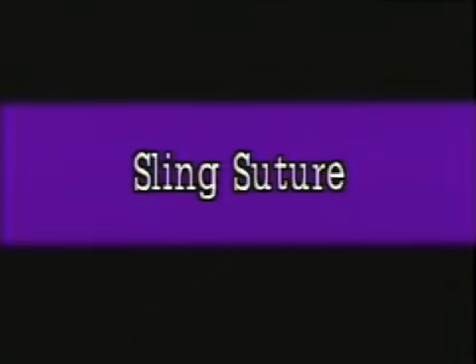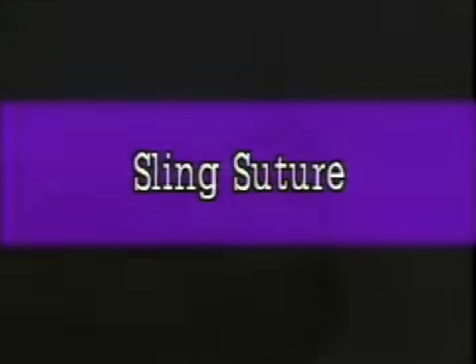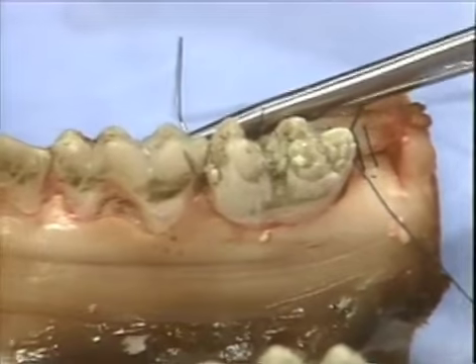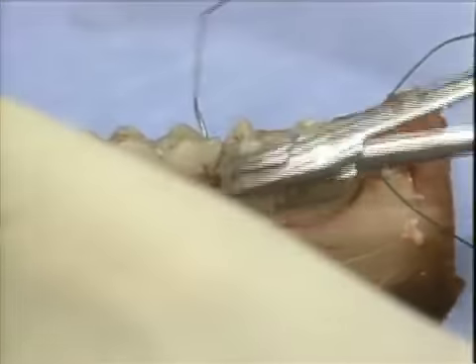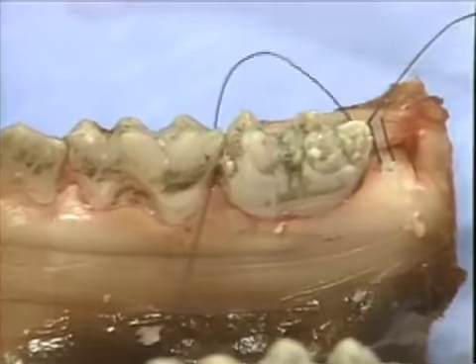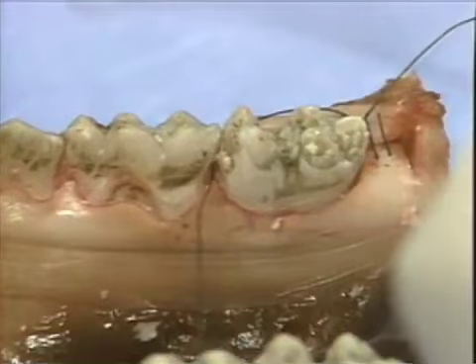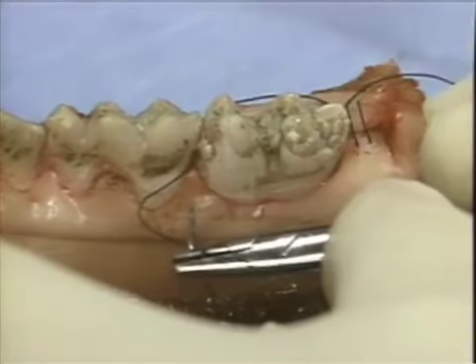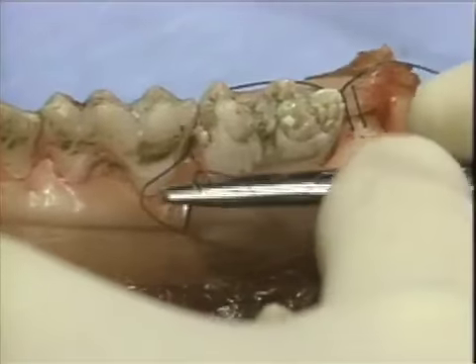We will now continue to suture the lingual flap using a sling suture, which will begin from the knot we have placed in the distal area. A sling suture allows preferential positioning of either a buccal or lingual flap independent of the other flap.